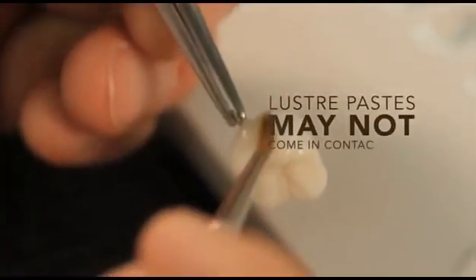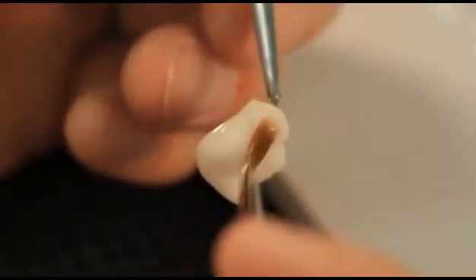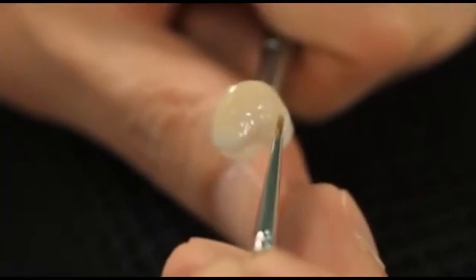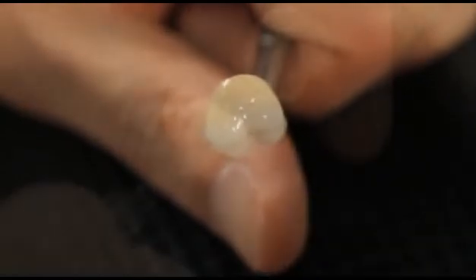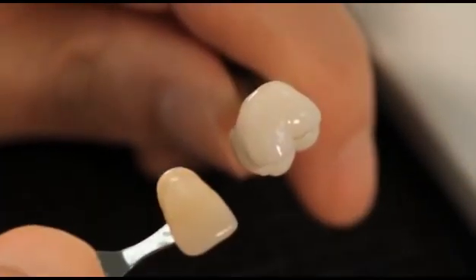Note: these Lustre Paste may not come in contact with water. The requested Vita Pan Classic shade is created by a more or less intensive application of the Lustre Paste Body A through D. This process, which only takes two minutes, is everything which is necessary to create Vita Pan Classic shades.